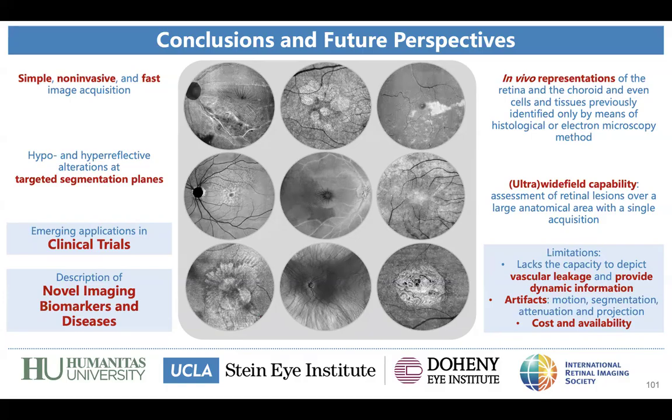In OCT, we always think about the application tomorrow, the next day, a few days later, and one main point is the segmentation. The segmentation is how the device names the lines that will separate that scan.